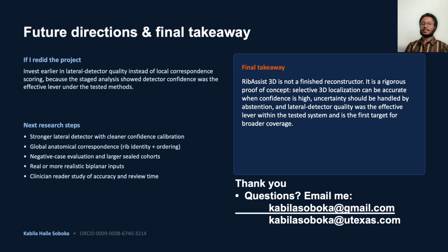The main takeaway is that RibAssist 3D is more than a reconstruction system. It demonstrates an assistive workflow, it shows how staged evaluation can identify true bottlenecks, and it provides a clear direction for future improvements. My long-term goal is to keep building AI that is not only accurate but also efficient enough to be deployed in resource-constrained healthcare settings like rural Ethiopia.